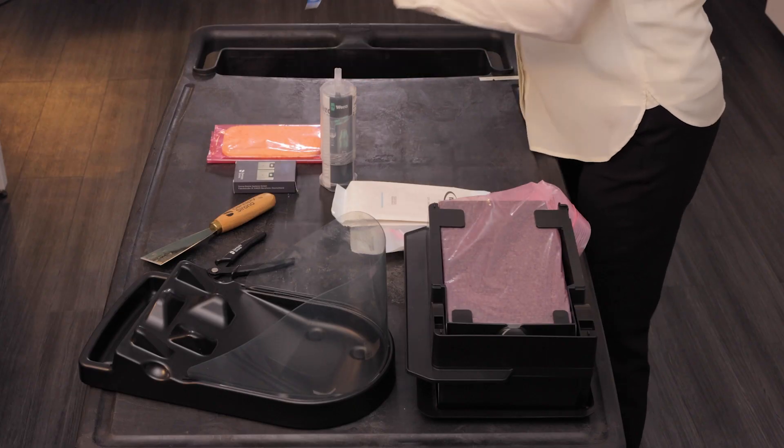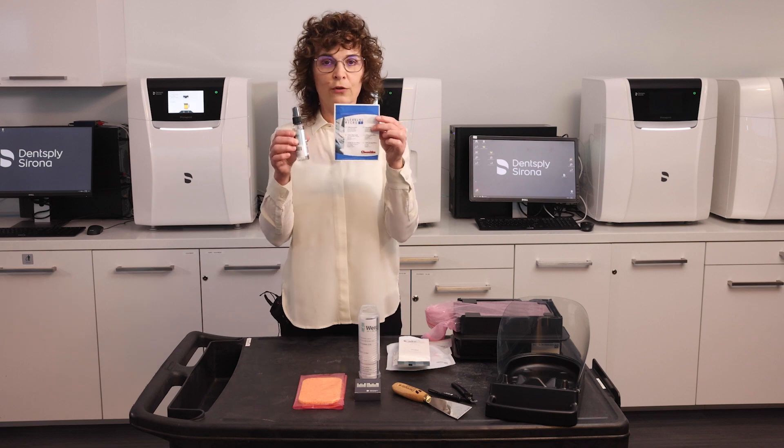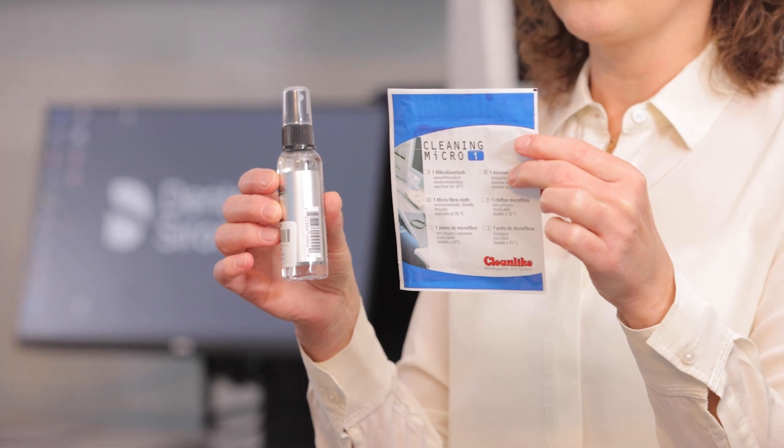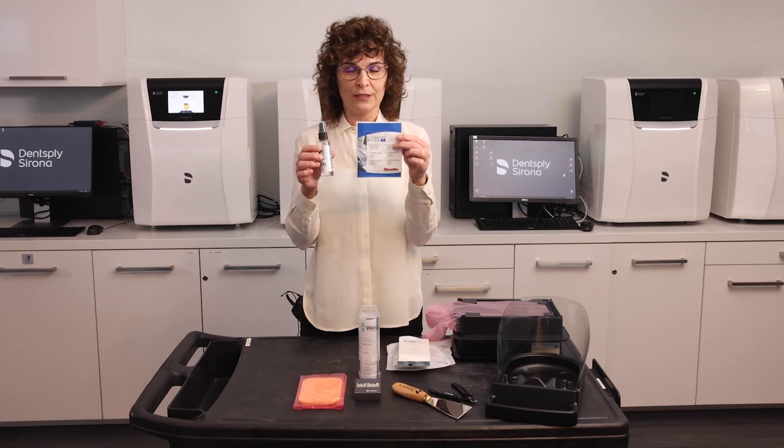Here is a PureSol lens cleaner with a microfiber cloth. You are going to use these two to clean the glass plate of your Prime Print when it gets soiled. Please refer to one of the videos that shows the steps on how to do this properly.